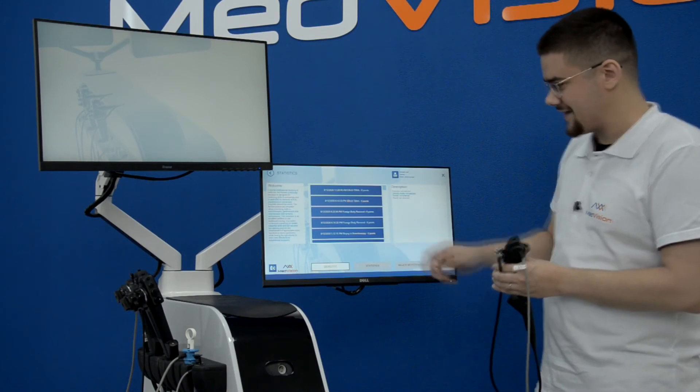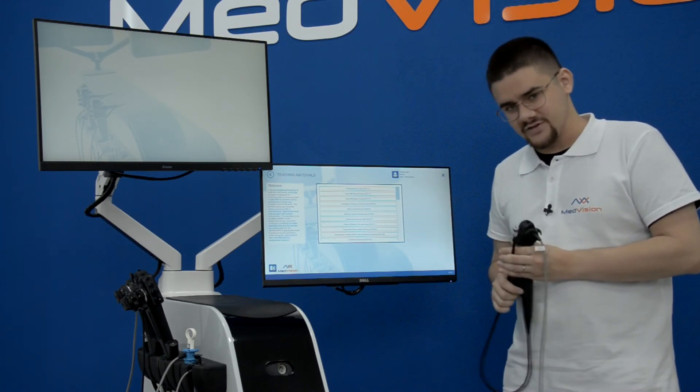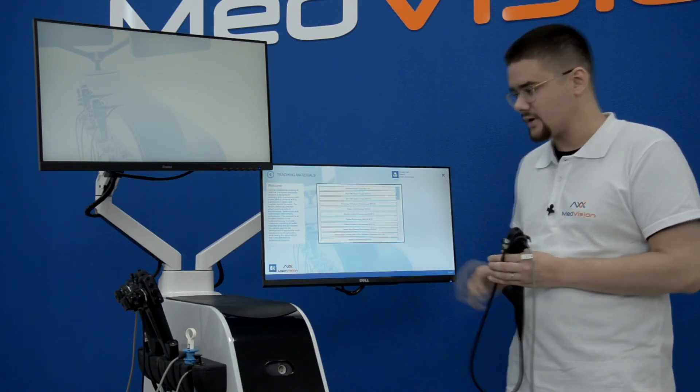Teaching materials are usually videos — just like with the LapVision simulator, you have actual surgery recordings and software module recordings performed by our employees.